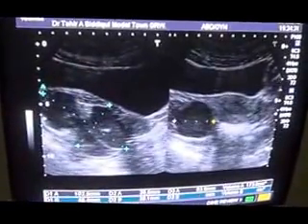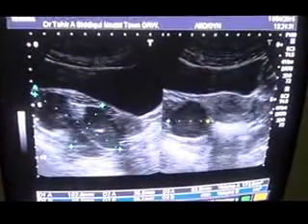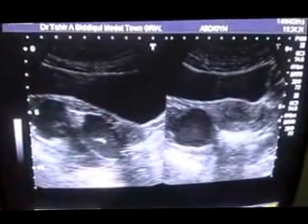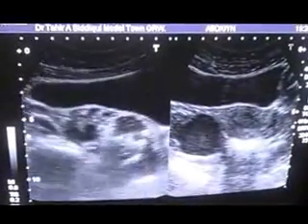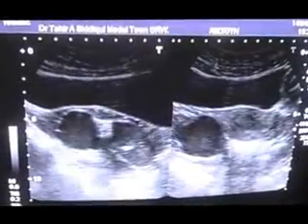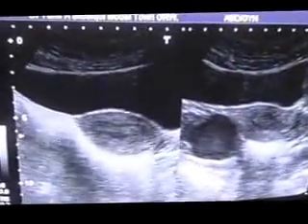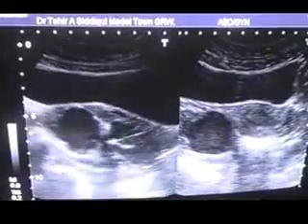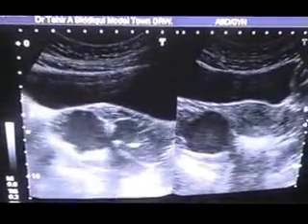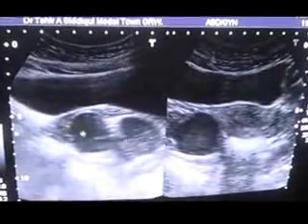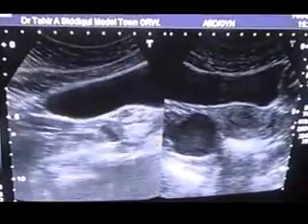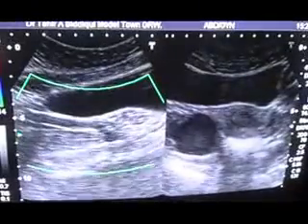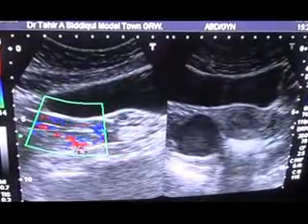So 173 ml is the volume, and this finding along with calcifications within it — for example, this is one of the calcifications seen within this mass — is consistent with pyosalpinx. This is the right pyosalpinx. Here in the region of the right adnexa you can see the echogenic cystic mass with calcifications. These are two other areas of thick debris, and this is a thick wall. These are the iliac vessels as you see them.